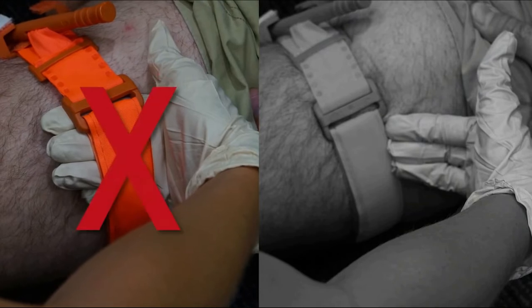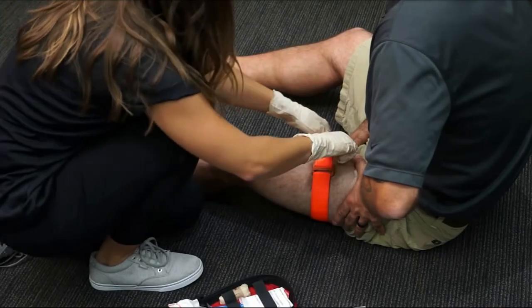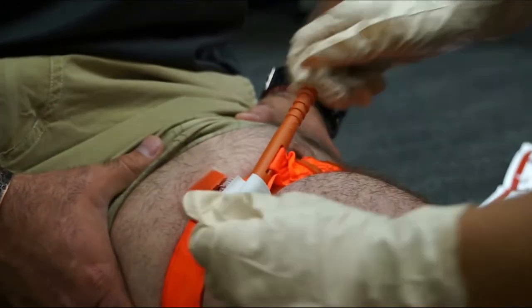If the tips of three fingers slide under the band, re-tighten and re-secure. Twist the rod until the bleeding has stopped. Secure the rod inside a clip to lock it in place.